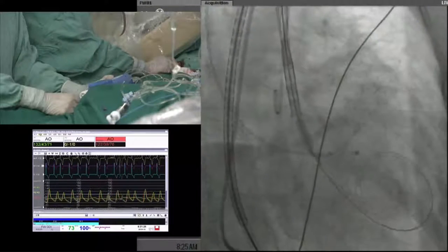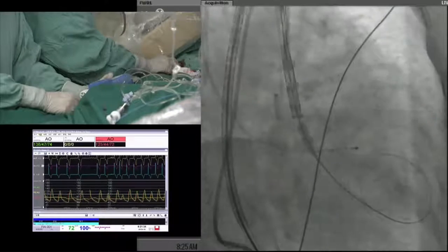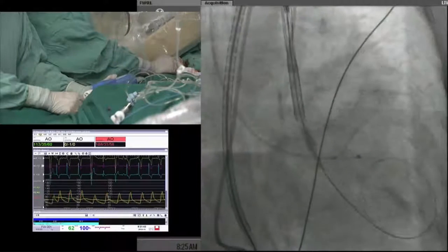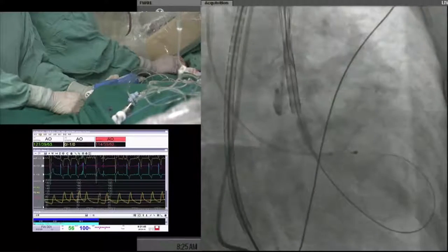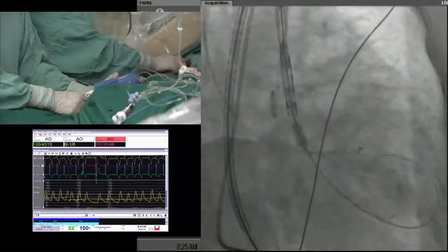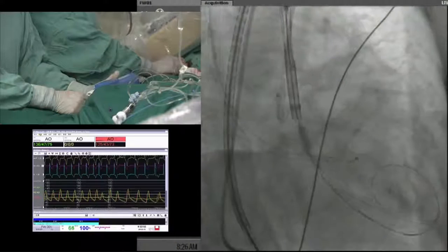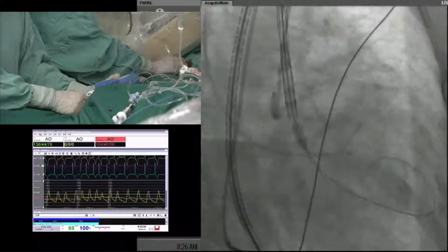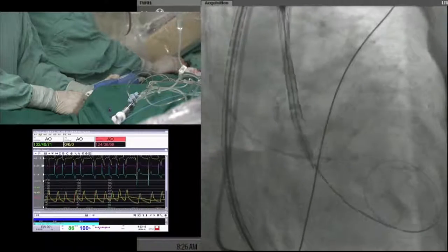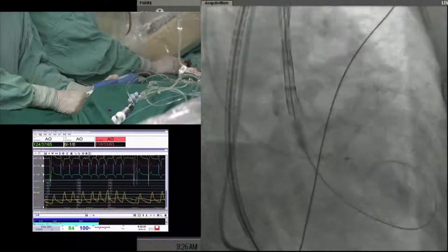How much of the valve can you expand and still retrieve it? 1 centimeter, 2 centimeters? I'm not totally sure, but it's started to open. Slowly. I think it's okay. The positioning right now is okay. So we should wait. It's perfect if it doesn't move. So now the pressure is good.